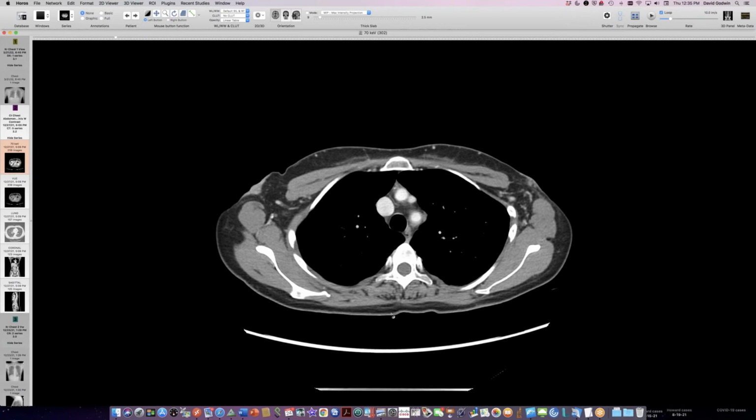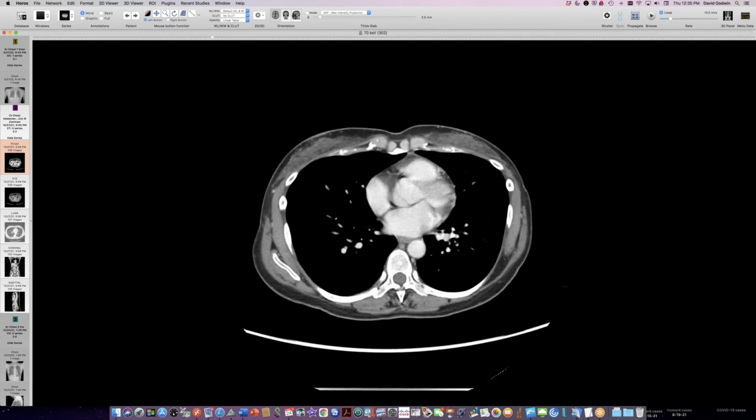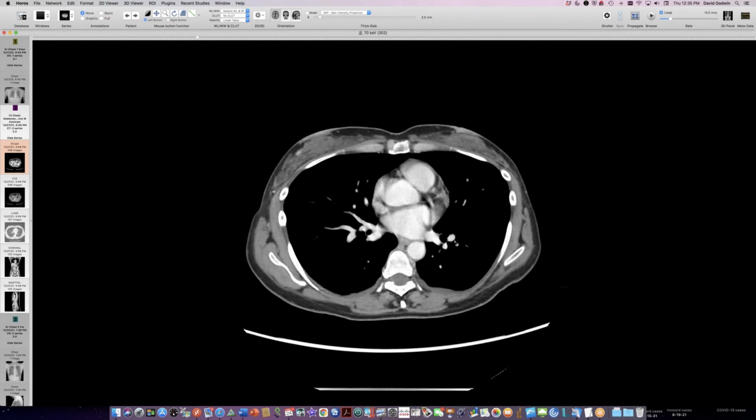Yeah, yeah. As a matter of fact, when I was showing this case to Sudhakar this morning, he pulled out a case of neurofibromatosis that had very dramatic phrenic nerve involvement. And he described these little ears hanging off the side as looking like a Shrek face to him, the mediastinum being round and then having these little ears protruding off it. I'll show that case next week. It's a dramatic case of really plexiform neurofibromatosis. Yeah, and in that case, you could actually follow the phrenic nerve out onto the surface of the diaphragm.